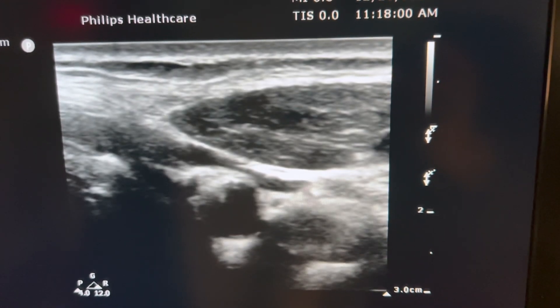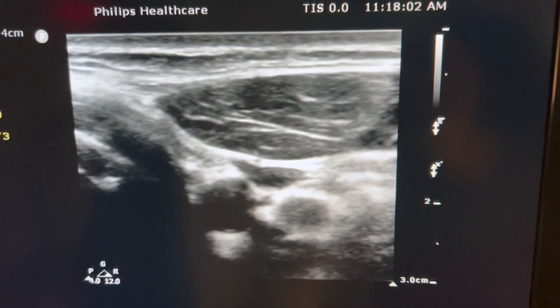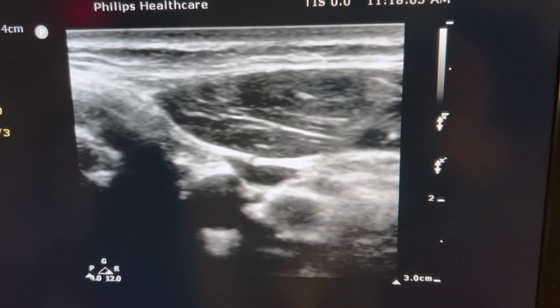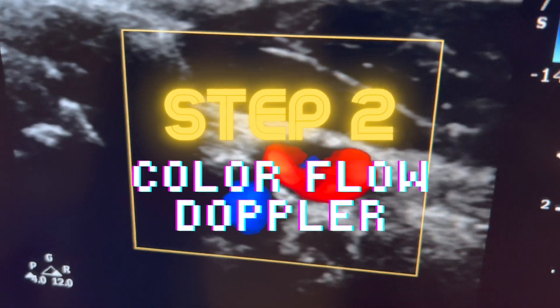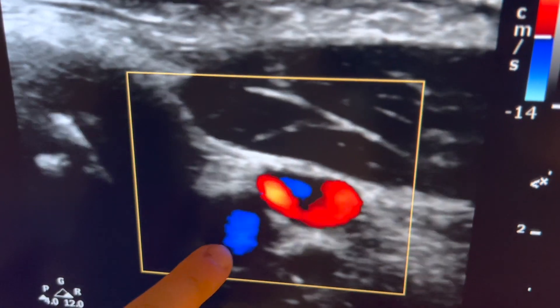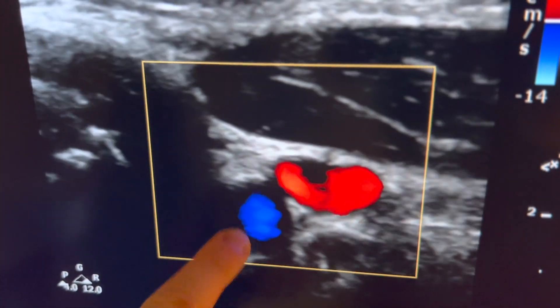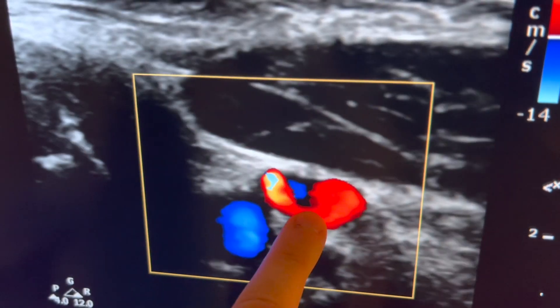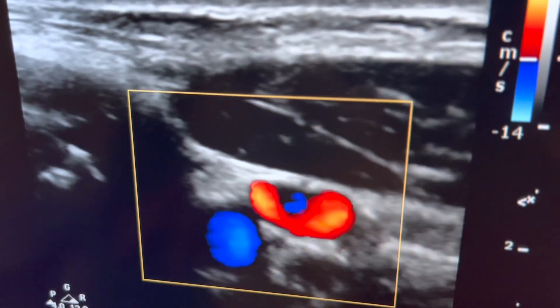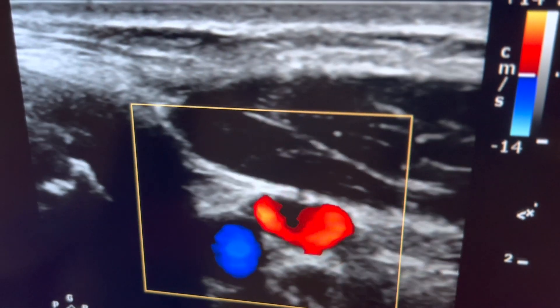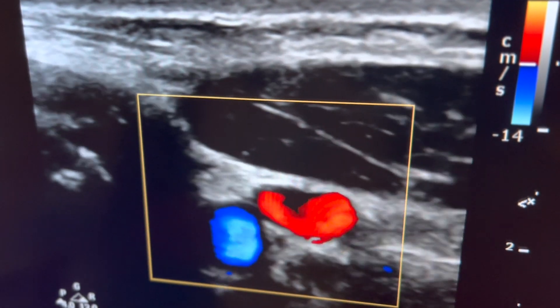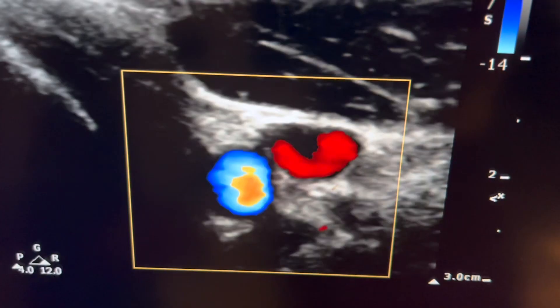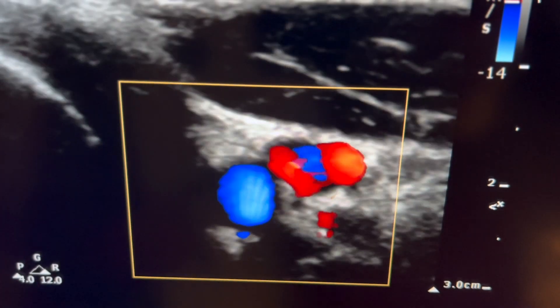Step two: how do we determine what kind of flow is in these structures? We use color flow Doppler. You've got pulsatile flow here and monophasic flow here. Monophasic flow is the flow you find in the vein — it has no pulsatility. The other one is pulsatile, which tells you that you're in the arterial system.